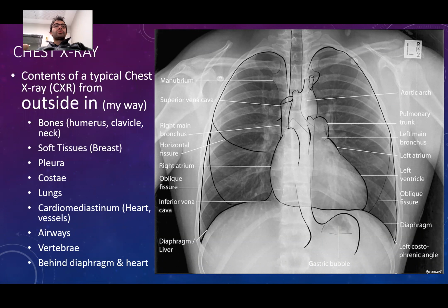Okay. So in the oral exam, I will be asking you when you're sitting in front of the screen. You may not be seeing the pathology in the first look. Some of the scans are difficult ones. So if you're missing stuff, just start the systematic approach. Many of our students, previous people in the oral exam, didn't find it in the first round, but in the second round of the systematic approach, they usually find the abnormality.